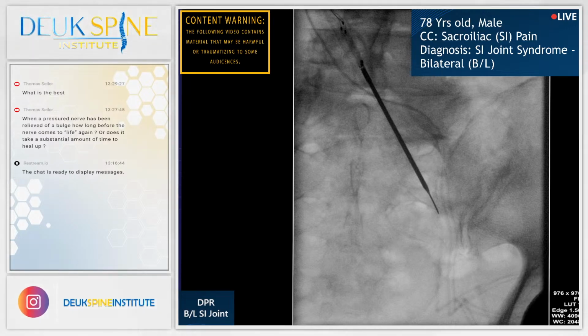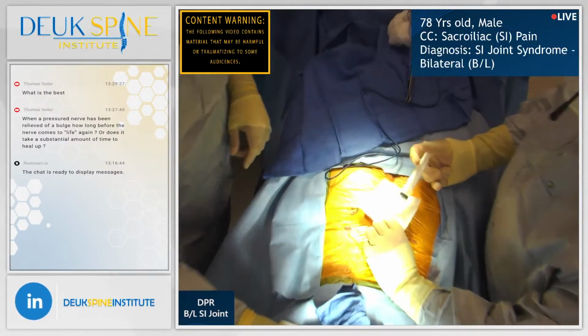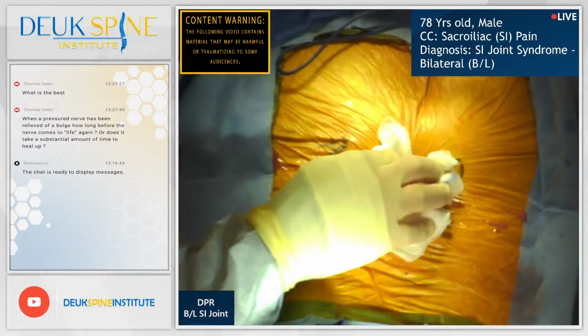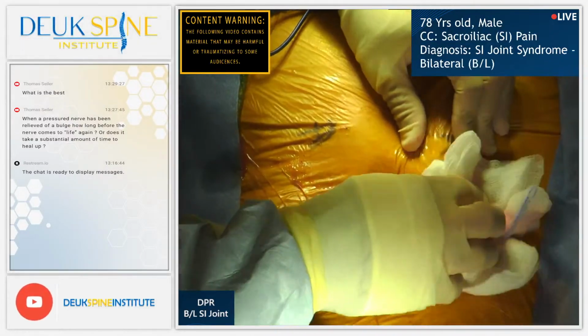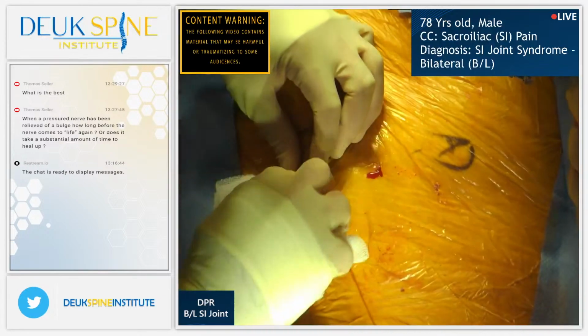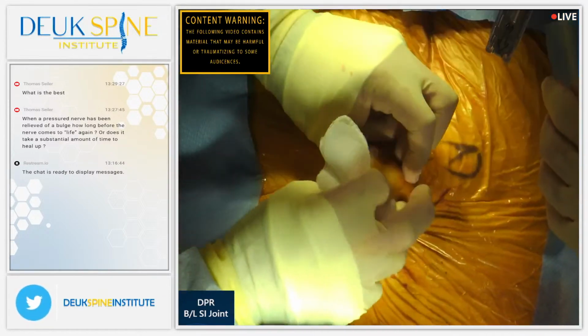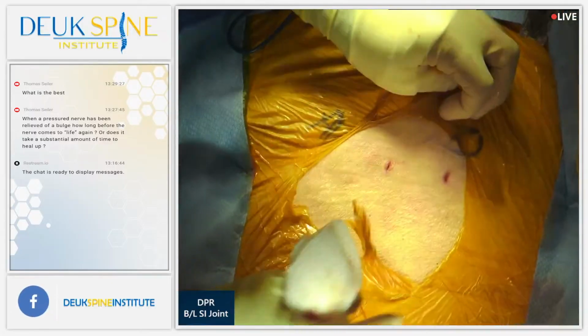But both incisions are 4 millimeters, tiny. There's really no bleeding with this surgery. And we put a little bit of medicine to reduce some inflammation, but that's it. We're going to take the bandage off and put 2 little staples, and he's going to go home. Come back tomorrow for a wound check, and then be done with this, hopefully, for the rest of his life.